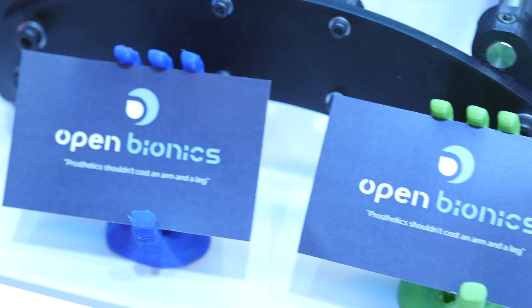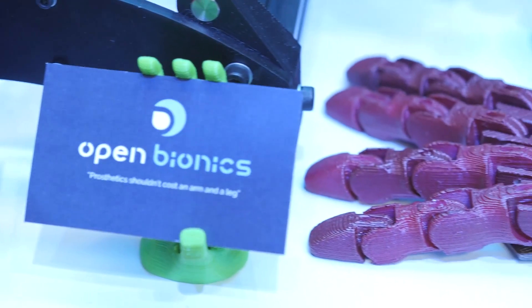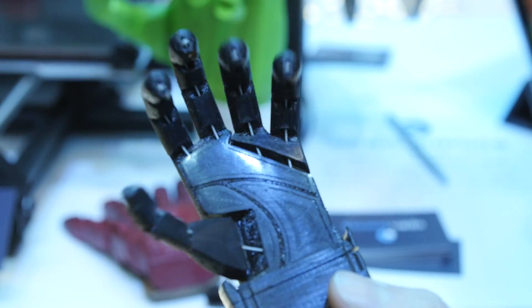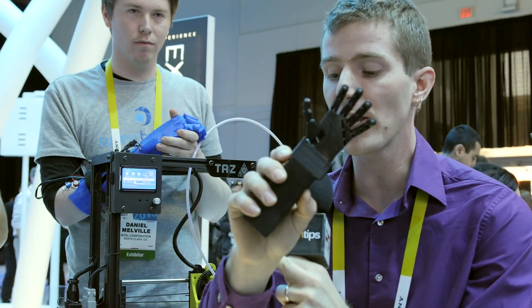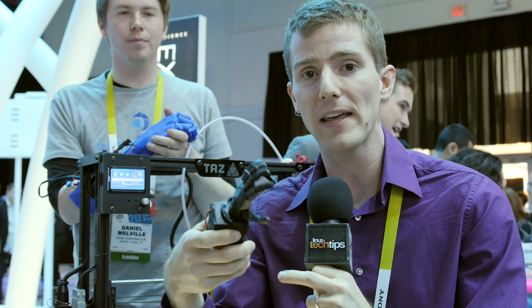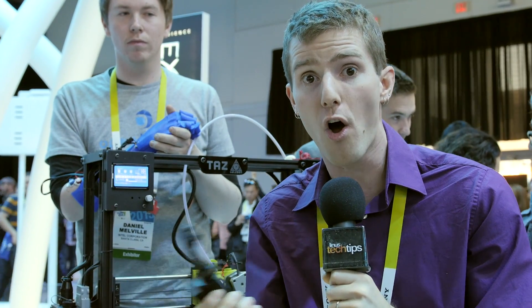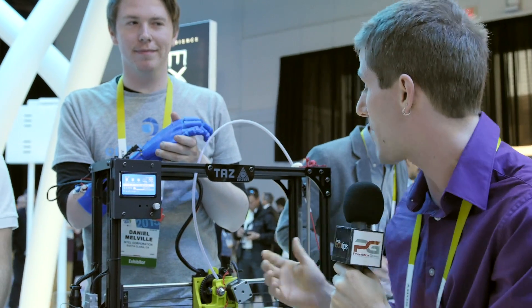We're kicking things off in the Intel booth with something really, really exciting. These guys are called Open Bionics, and they're using Intel's RealSense 3D camera in order to print 3D hands and then scan the arm that they are going to create a socket for, and then they can put the hand on someone who doesn't actually have a hand. Holy crap, this is amazing.